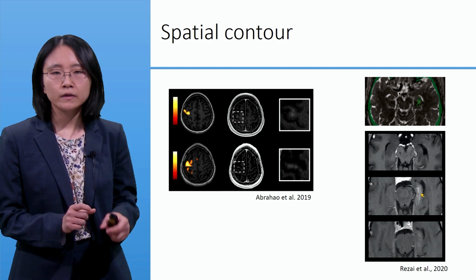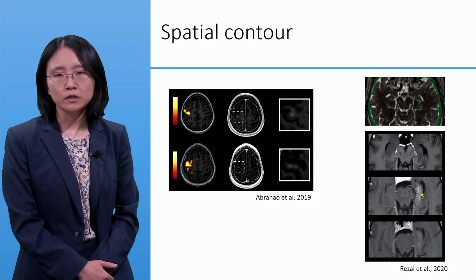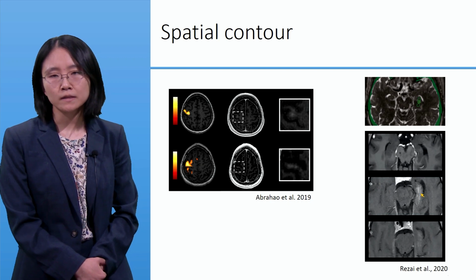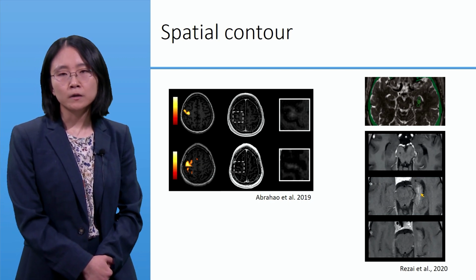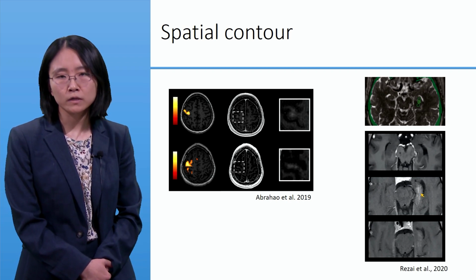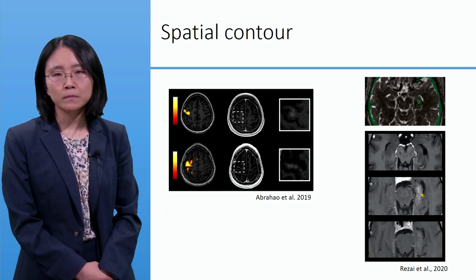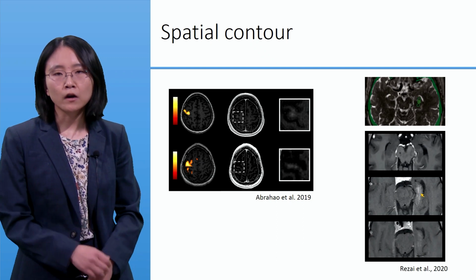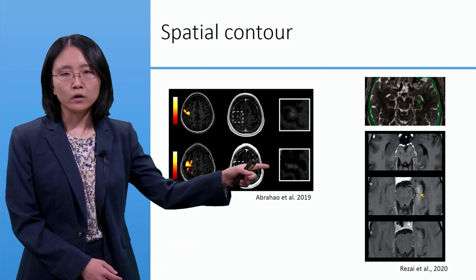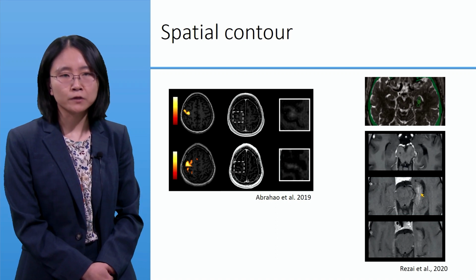that the clinician desires. So we take the example of an ALS population where the primary motor cortex is implicated in their disease. These patients underwent fMRI in order to further delineate the hand region of the primary motor cortex. And after we found these areas using functional MRI, we used the hotspots for targeting and were able to show increased extravasation, or increased permeability to gadolinium, after sonication in an exact area of target.